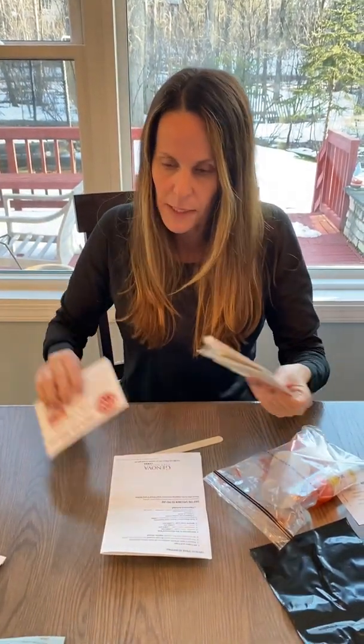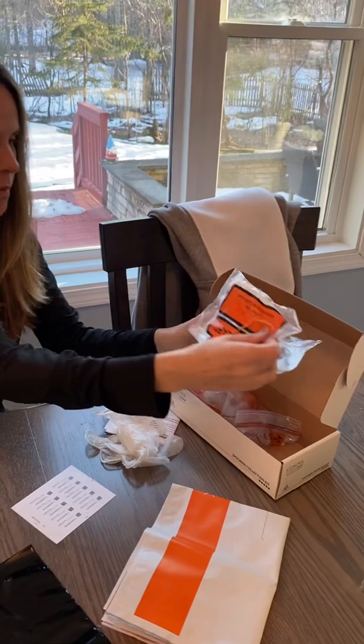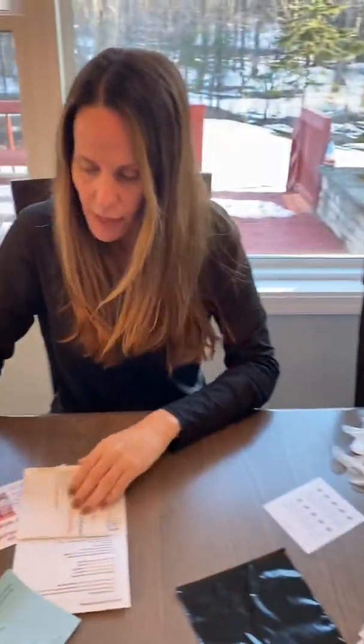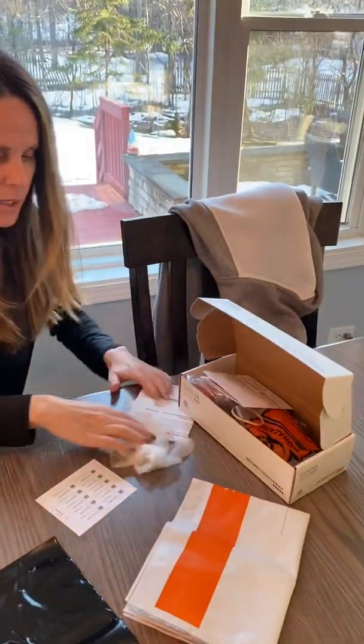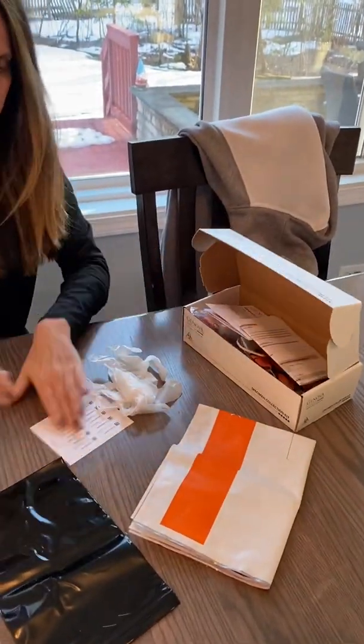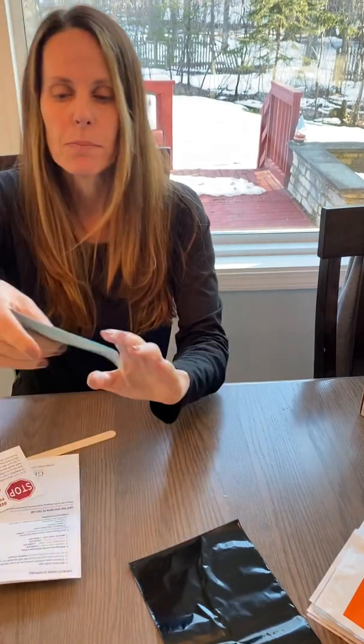So I hope that explains everything. Just to sum it up, you'll end up having 4 samples, 3 go in one bag and 1 goes in a bag by itself. And then you'll have your test requisition, which you can either put back in the top or put in here, your questionnaire. These are what you put on the tube, so this is going to be the date of collection. You'll throw out your gloves. This blue piece of paper that refers to Atlanta, throw it out. This again gives you information on what you're supposed to fill out and not overfill the tubes. That could get thrown out.